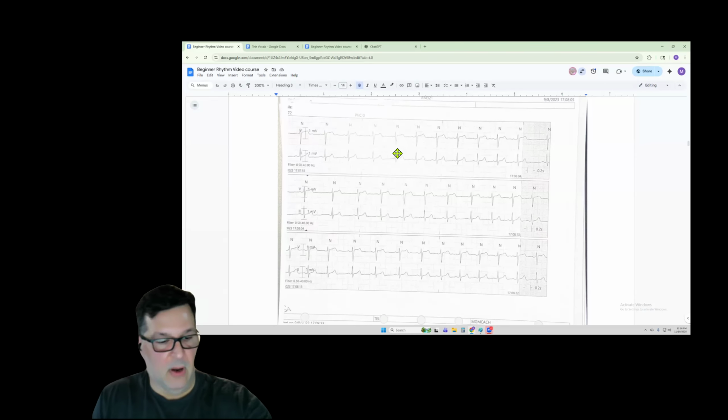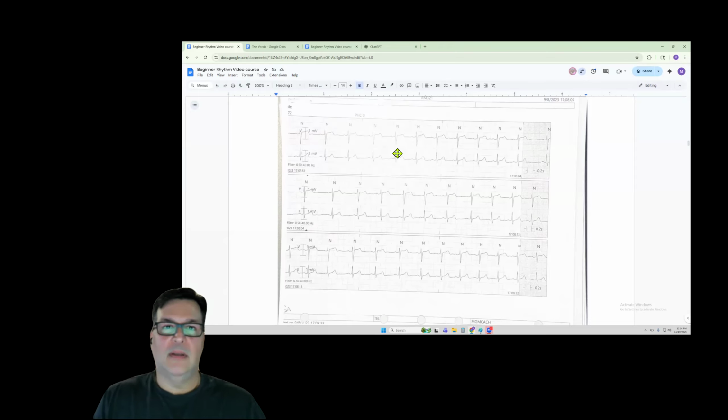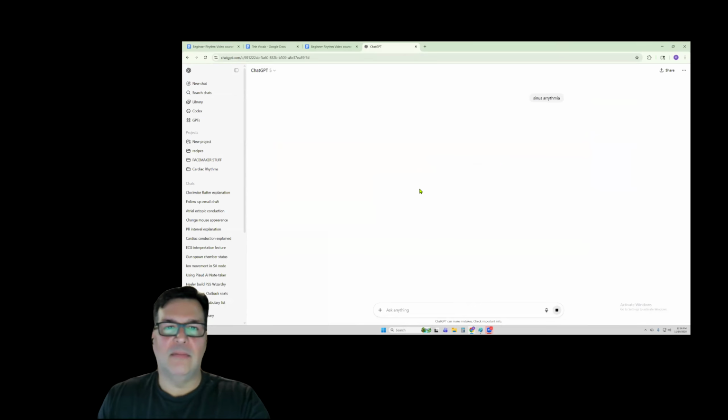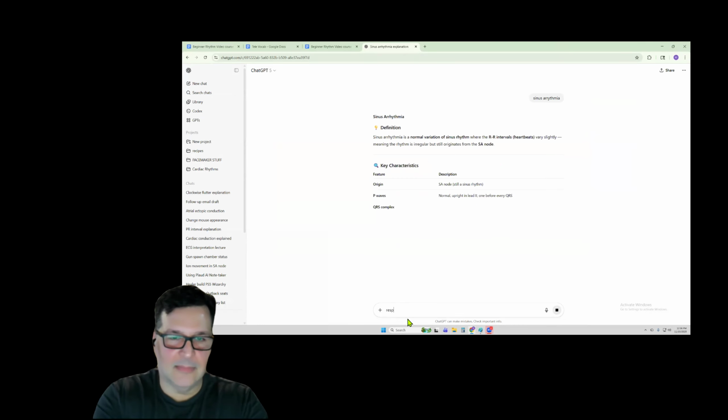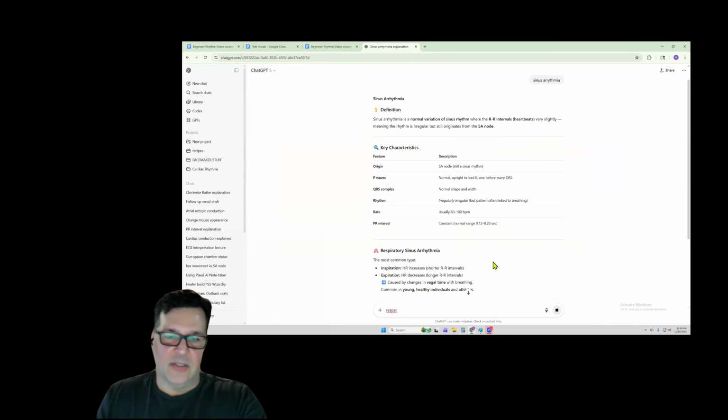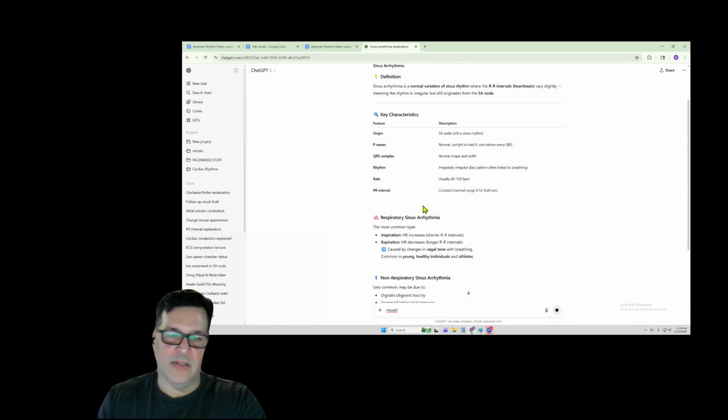Yes, I'm probably saying that wrong, but it's a 50-50 chance here. It switches a little bit with breathing in versus breathing out. You can't make me look it up. Pretty sure it's breathing in. Emily, you got an answer? No, I don't. Sorry, I'm losing this round of Jeopardy. That's okay. You guys both win more than me. I do know, like, inspiration increases, expiration decreases. So I was backwards.